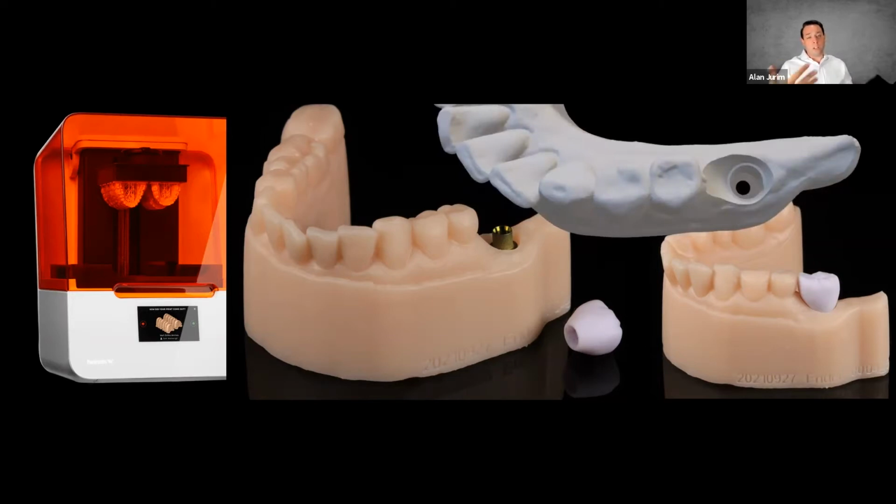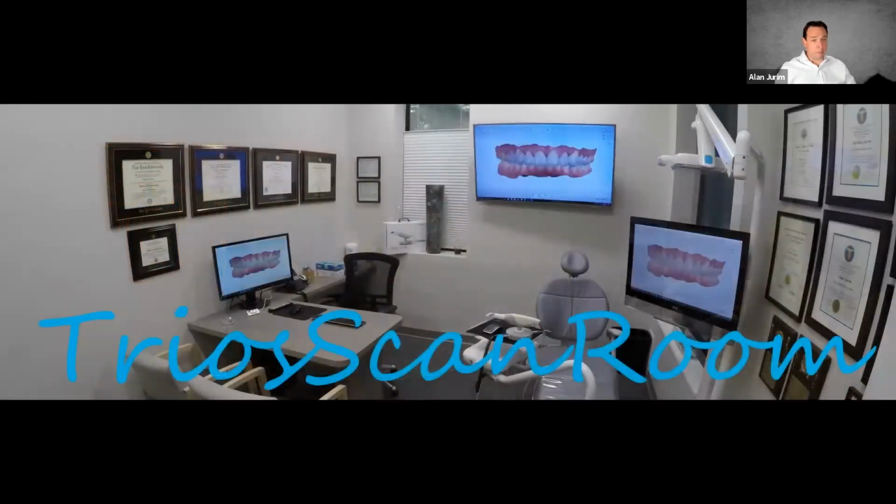And so when you have these models that get generated, whether they're designed by you in your office or by your laboratory technician, you have a very easy way of producing this on site and using this to your benefit if you feel like the workflow can benefit from it.